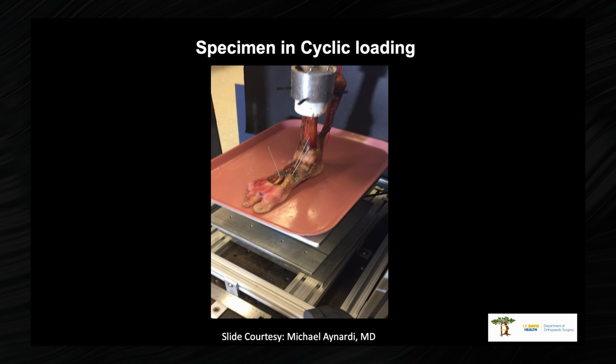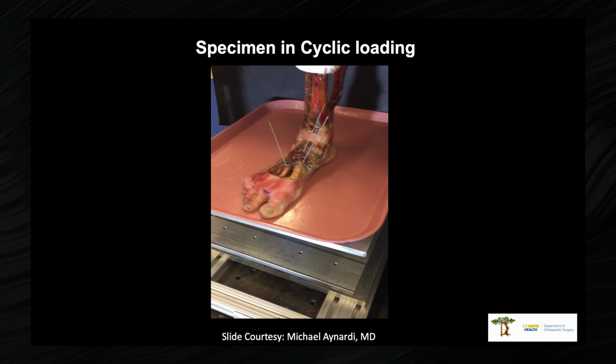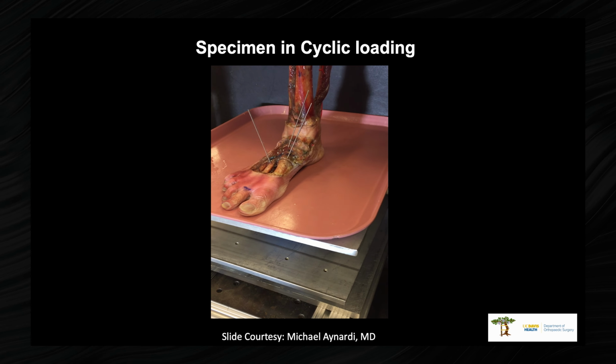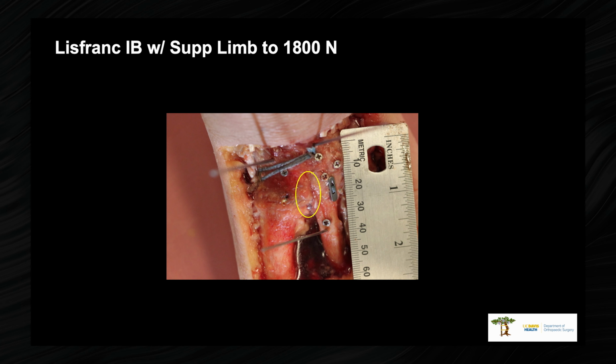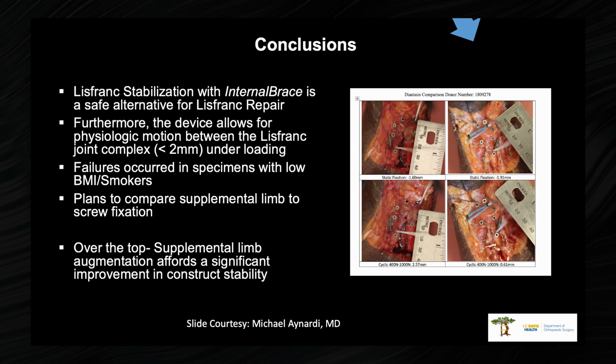So he did this very elegant study, and I don't have all the slides in here, but he did use a cafeteria tray as part of it. They have this very elegant biomechanics lab, but they needed something very flat, and you can see that there. And they were able to reproduce the LisFranc injury, and then they also showed that doing it versus screws, that you could reproduce it, and that the over-the-top actually supplemented the InternalBrace repair.